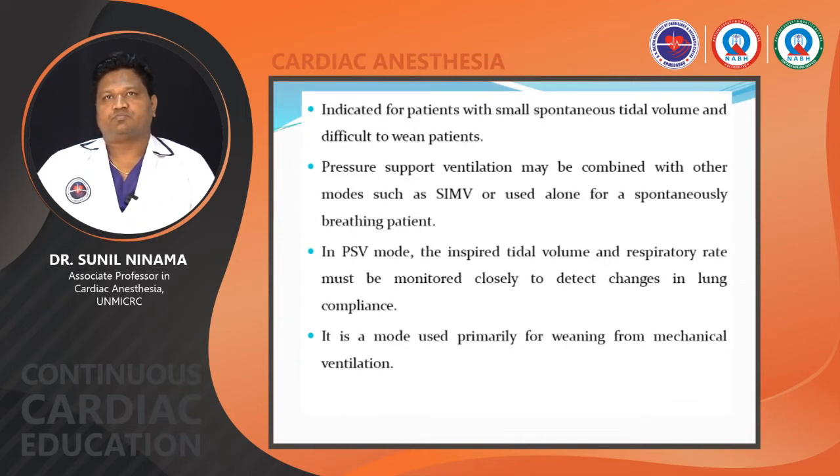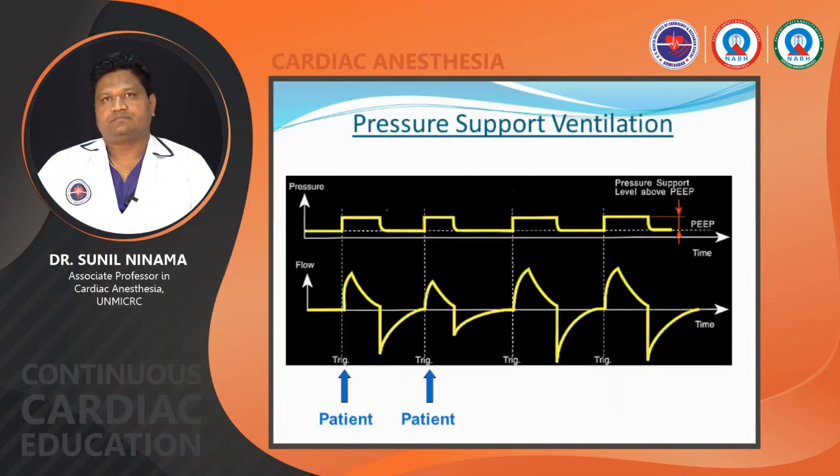It is indicated for patients with a small spontaneous tidal volume and patients who are difficult to wean. Pressure support ventilation may be combined with other modes such as SIMV or used alone for spontaneously breathing patients. In this mode, the inspired tidal volume and respiratory rate must be monitored closely to detect changes in the lung compliance. It is the mode used primarily for weaning from mechanical ventilation. These are the features of pressure support ventilation. You have to see the graph of this.